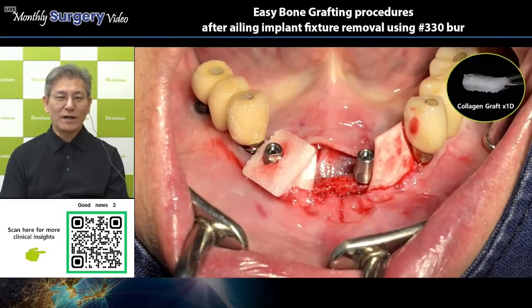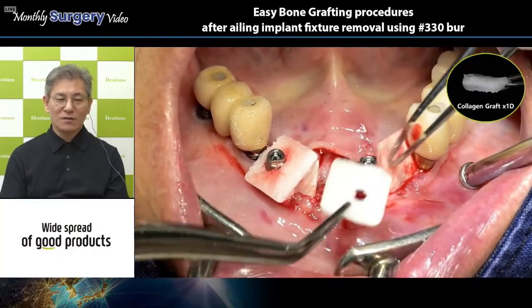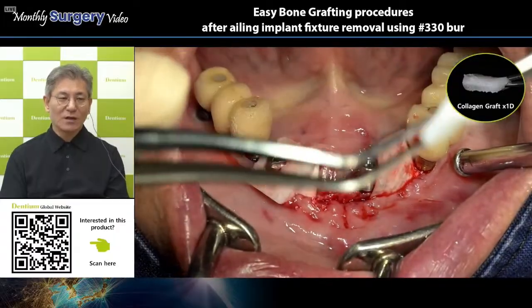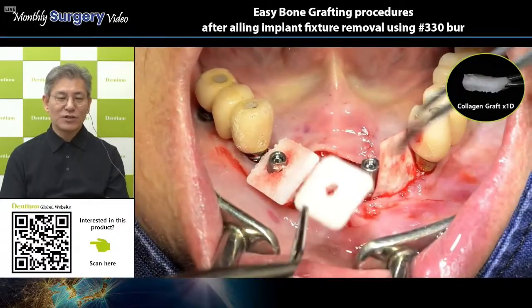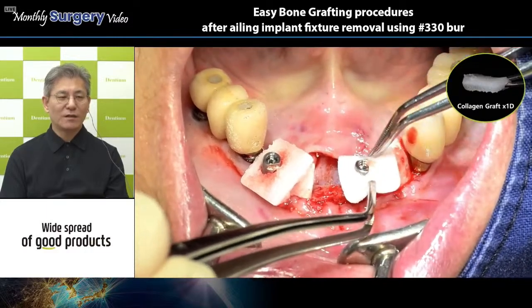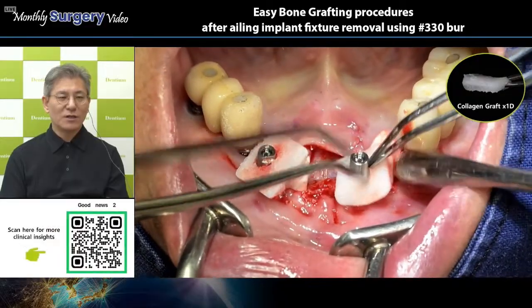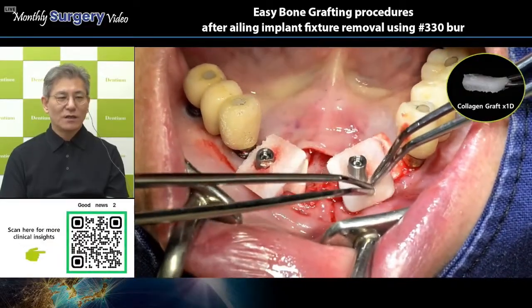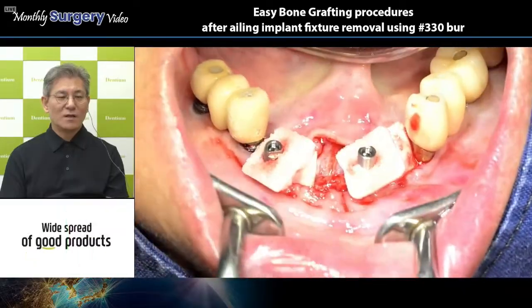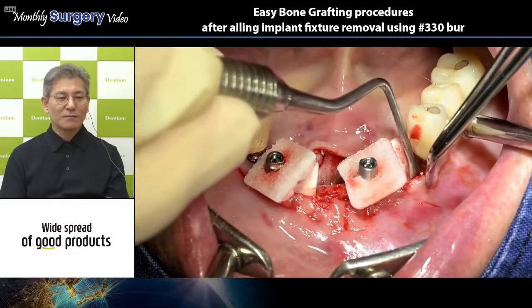However, if you want more stability in this area, you can use pin fixation using the pin, or periosteal suturing. Okay. After that, make a small hole using a punch and connect the collagen graft with this scan comfort cap.